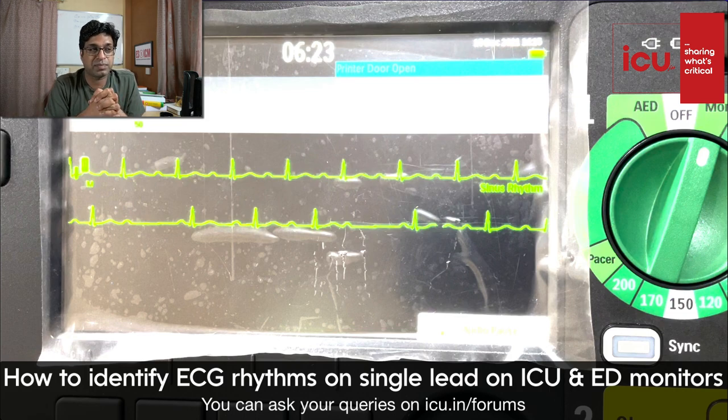Suppose a newly joined employee in your ICU came at 9 o'clock on the first day, then at 9:10, then at 9:20, and then at 9:30, and now the next day he won't come. So you are well prepared that the fourth day, when he comes at 9:30, he will not come. So you can predict the pattern. So it is not so significant at times. Usually a pacemaker is not required, but if a surgery is done or the patient is planned for cardiac fitness, they may advise something for this.